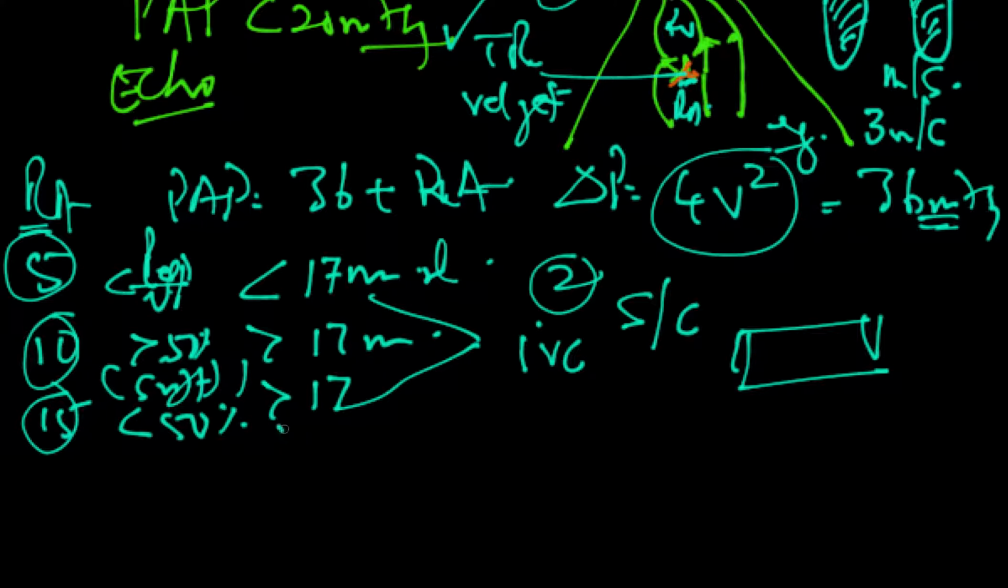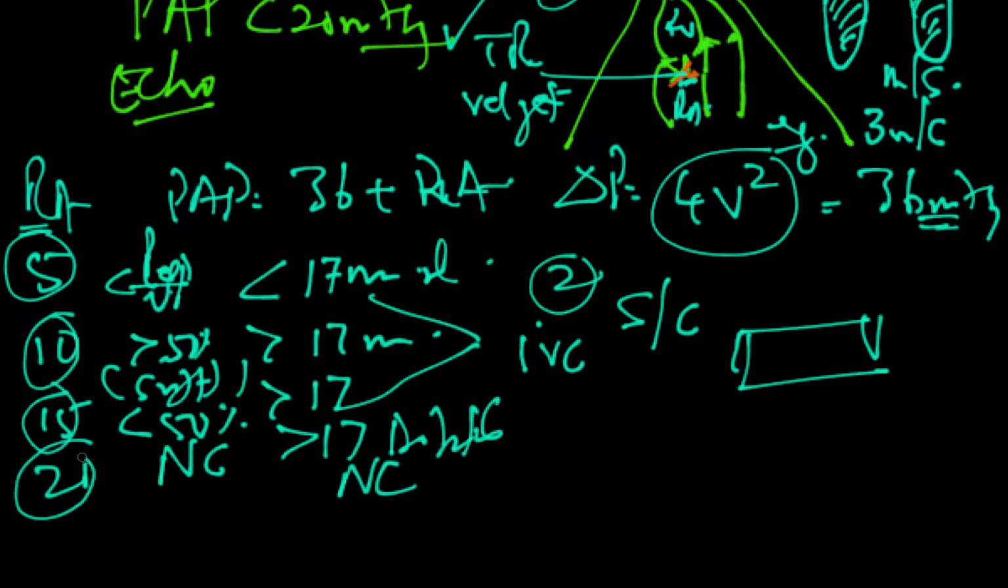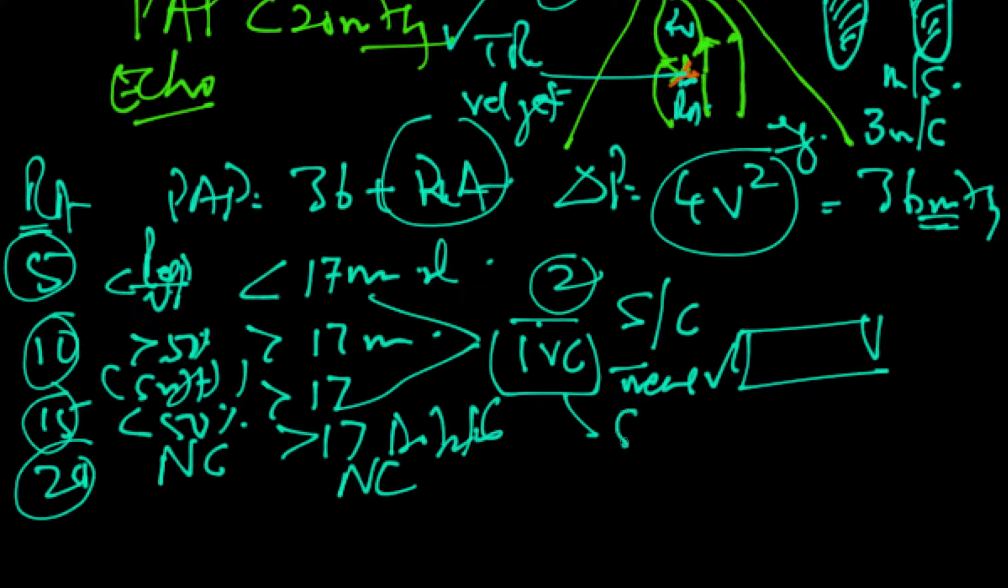And then, of course, if it is more than 17 and there is no change from the sniff, the IVC is dilated, obviously 17 is dilated, and there is no change, then you compute 20 as your RA pressure. So RA pressure can be 5, 10, 15, 20, depending upon what you see in the IVC and in the compressibility. IVC measurements have to be done. Measure that, and then you have to do the sniff test. So two things, very simple.